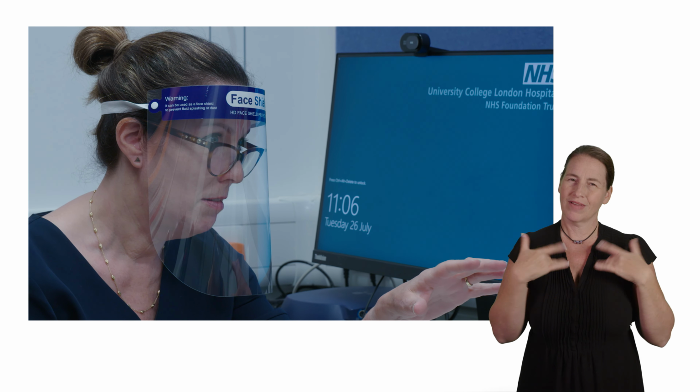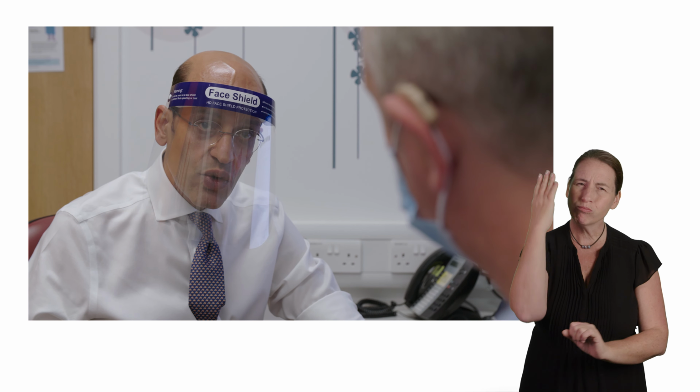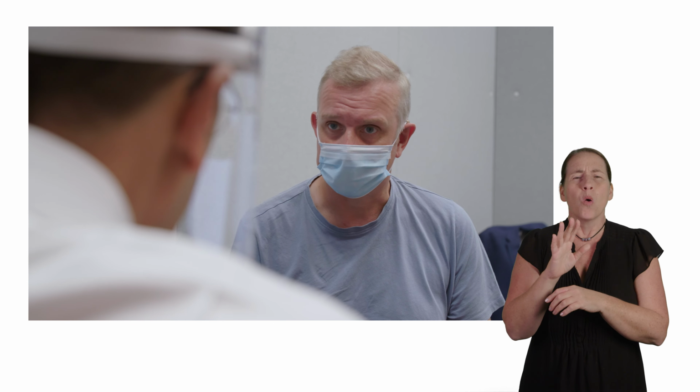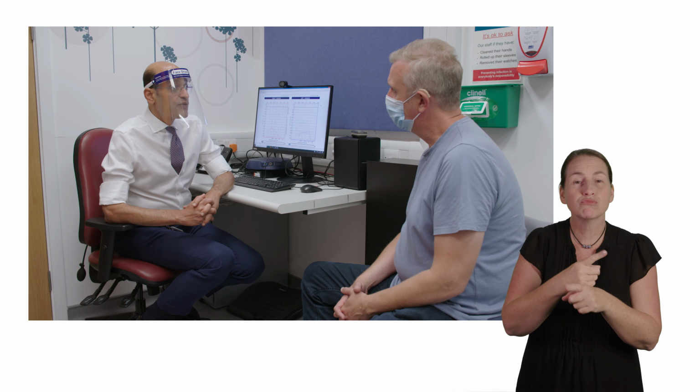When you meet the speech and language therapist, they will look at why you want to have a cochlear implant, how your deafness affects your communication in everyday life, and how the cochlear implant might change that. We need to make sure that your expectations will actually meet what we think we can offer you with a cochlear implant. Tell me about your hearing loss. When did you first notice it? About 10 years ago. And did it affect one ear or both ears? Both ears. The surgeon will talk to you about the history of your deafness and look in your ears and try to establish a cause for the hearing loss if that's possible.